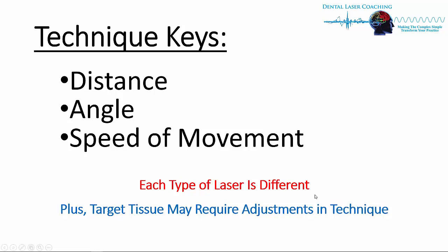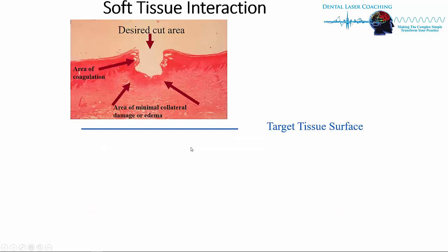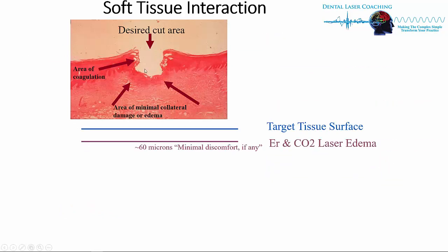The other thing that's key is you could probably close your eyes and do a class 1 or 2 preparation. This is non-contact dentistry. So again, we're juggling these 3 things while learning the physics of it and the interaction of it. And when we do that, we get tremendous results. As you can see here, this is a cut with the laser.